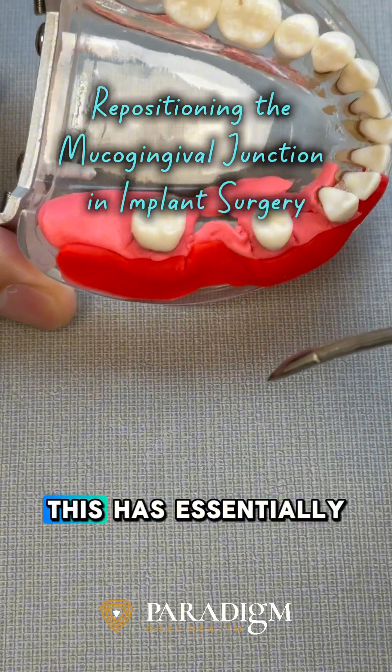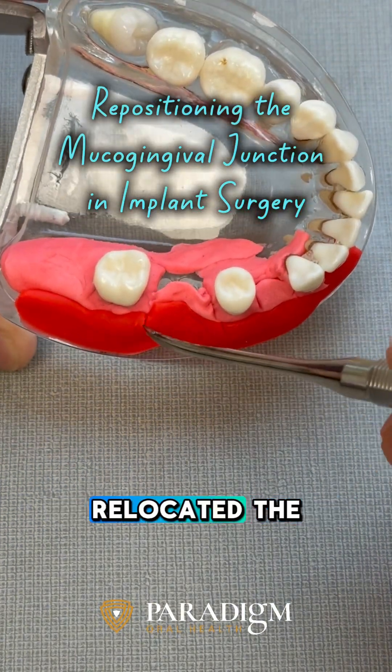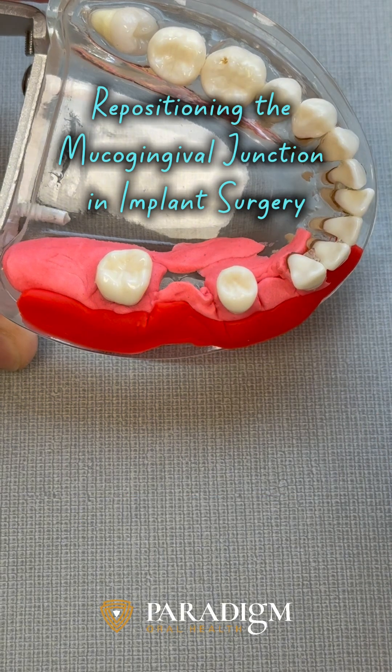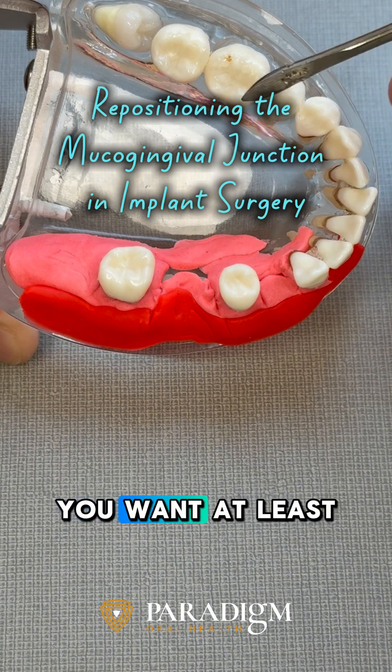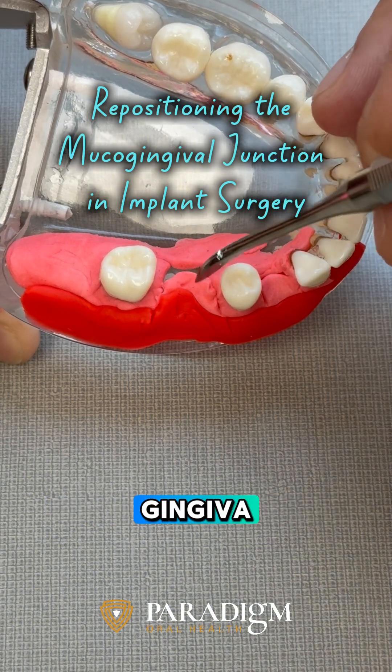As you can see, this has essentially relocated the mucogingival junction too close to where we're going to restore with the implant. And as you know, you want at least about two millimeters of attached gingiva all around the implant.